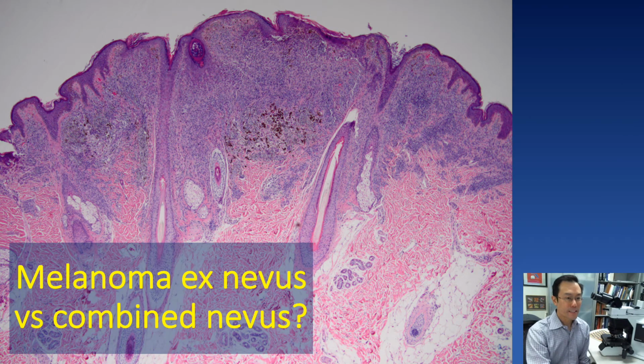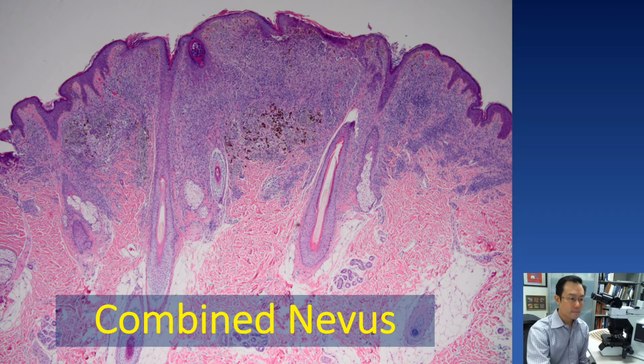Okay, experienced trainees, pause and diagnose. Is this melanoma arising in a nevus or a combined nevus? Good news, combined nevus.